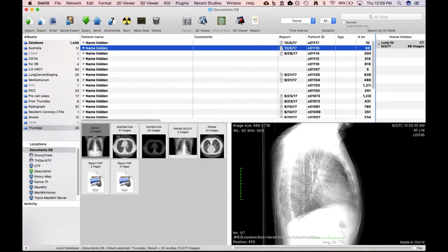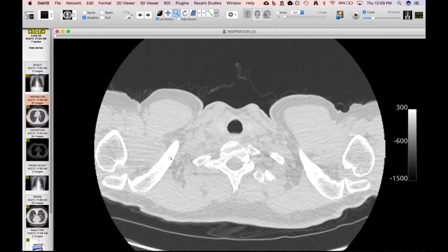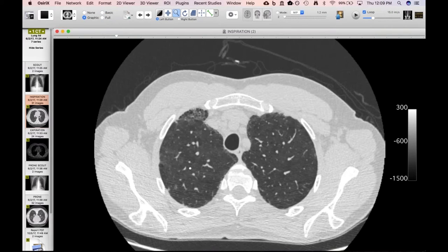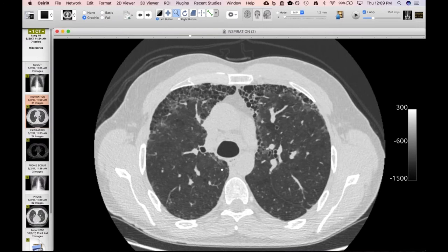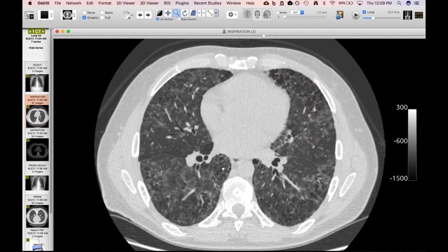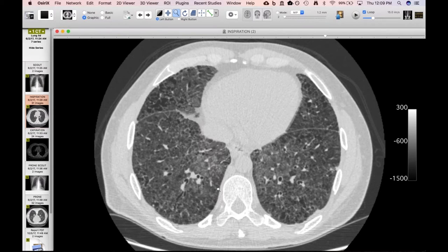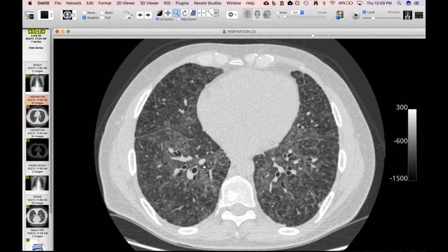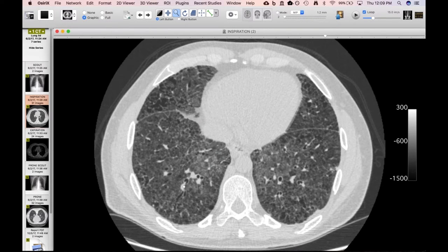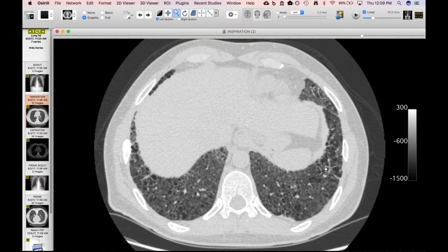Now this one is kind of a cool case, and I actually have two related cases. This is one from a couple of weeks ago. And this is a 41-year-old man who had worsening cough for about a year, finally sought medical attention. And you can see that he has a fibrosing interstitial lung disease on this CT. And it's a very peculiar pattern. You can see it's very spatially homogeneous in the lower lobes. It's a very diffuse process with ground glass, some traction, some little cystic spaces.